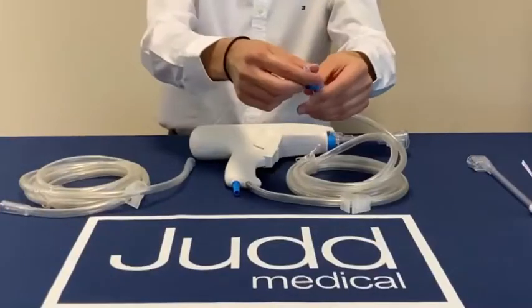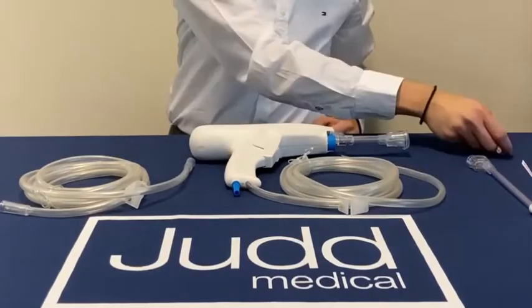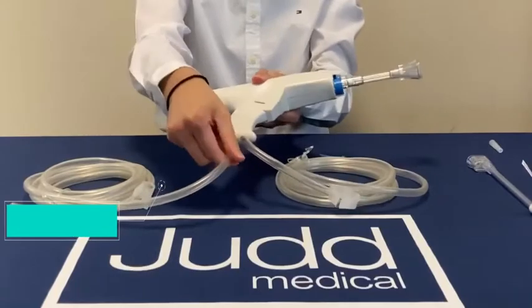Remove the blue connector cover on the irrigation line and insert it into the saline solution. Then simply attach the 3m suction tube to the base of the handpiece.